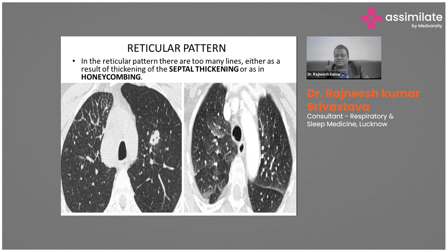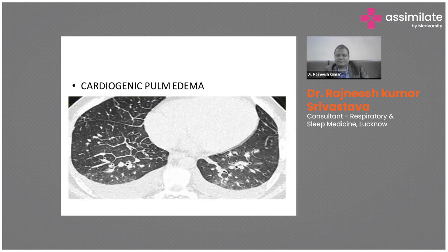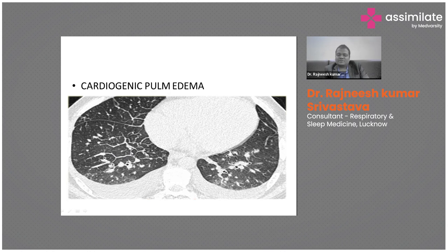A detailed clinical history is always needed alongside imaging. In a patient with cardiogenic pulmonary edema, CT shows diffusion changes and septal thickening beautifully. The secondary pulmonary lobule septa are clearly prominent on CT in diseased areas, whereas in normal areas they are very thin or invisible. Pulmonary edema increases pressure in veins, which run in the interstitial septa of the lobule, causing those septa to become prominent and visible on CT.